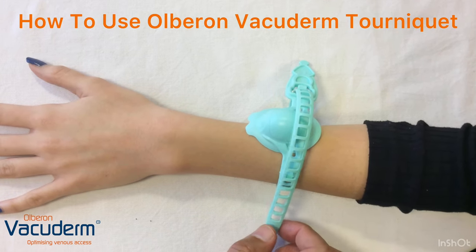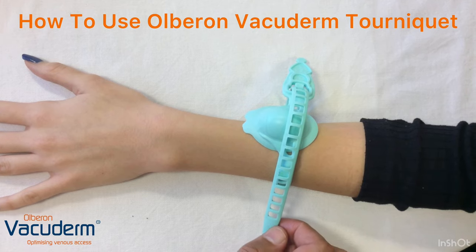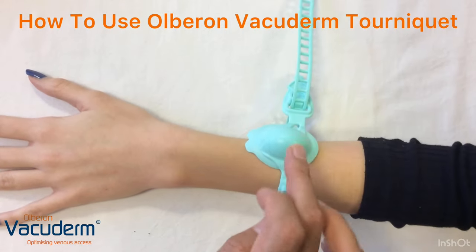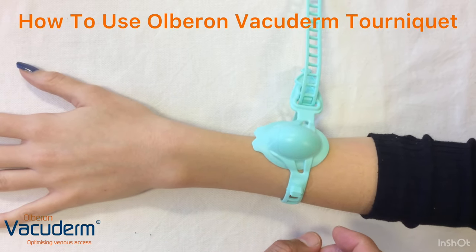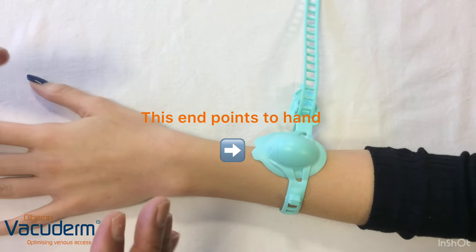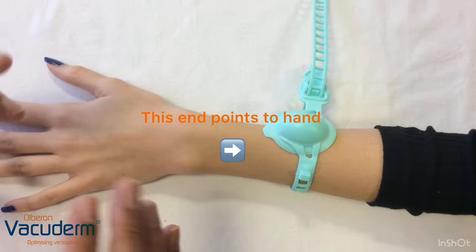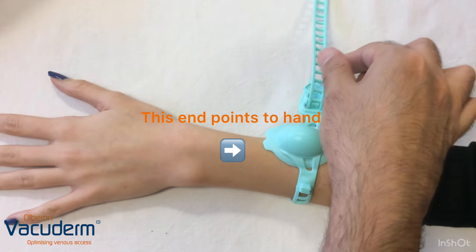This demonstrates the effect of the Vacuderm Smart tourniquet. It has a dome that pumps the vein in addition to the tourniquet effect, which gives rise to further blood coming to the vein, further distending and making it tenser and a better candidate for cannulation.